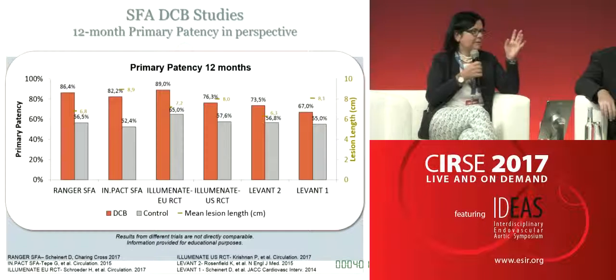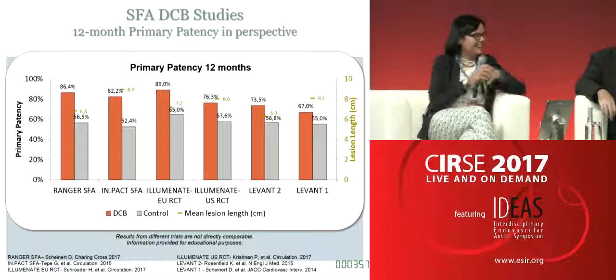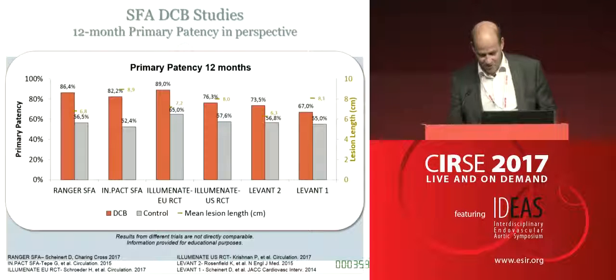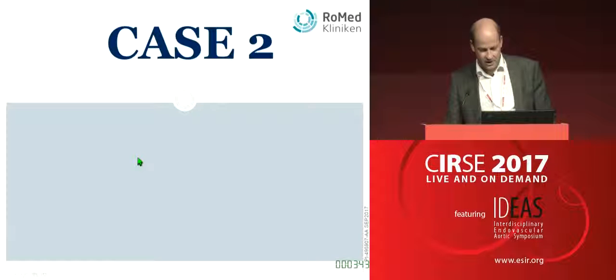Okay, I have to interfere here a little bit because I have also limited time, and if I do discuss in between, I have no control of that anymore. Okay, sure. So I try to control this a little bit. Over here, again, my point is, in the case, short lesions, also DCB. And this can be also seen in this slide over here.